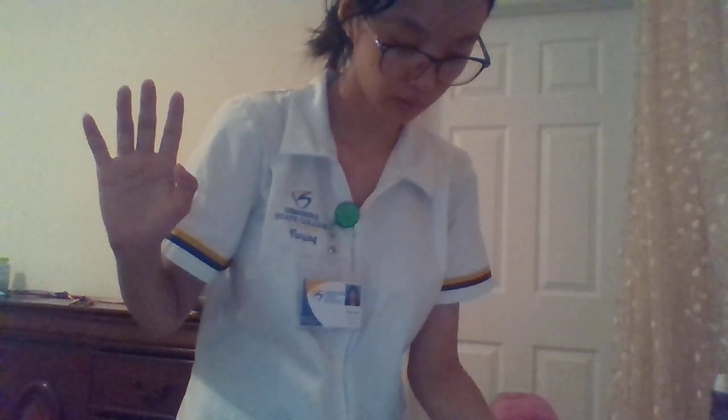And after that, I'm gonna use the one hand technique to recap it. And I'm gonna label my syringe with the patient name, the drug name, which is vitamin B12, and the 0.5 ml, as well as 500 mcg, and the time and date. And I put my initial on here.